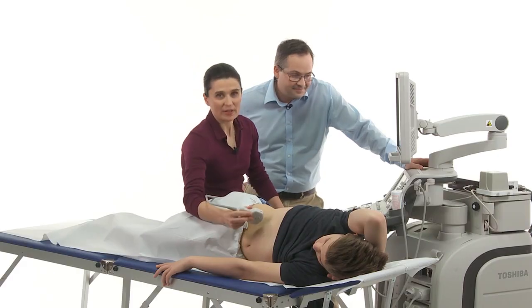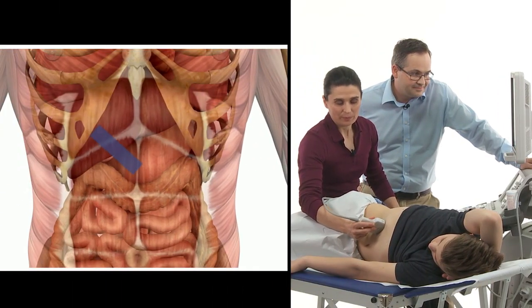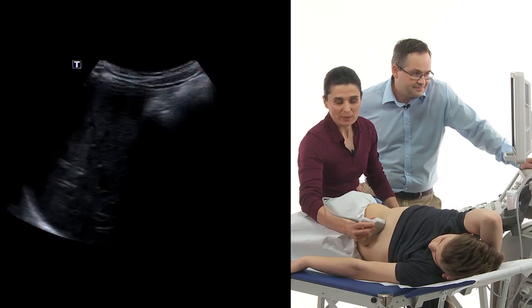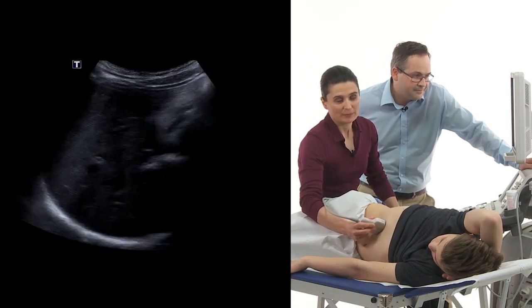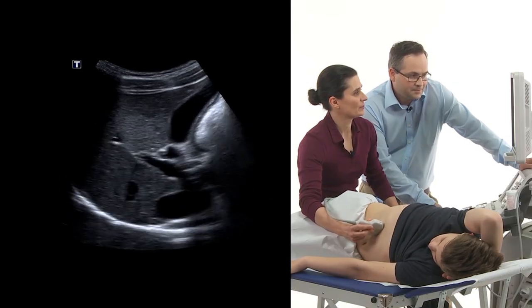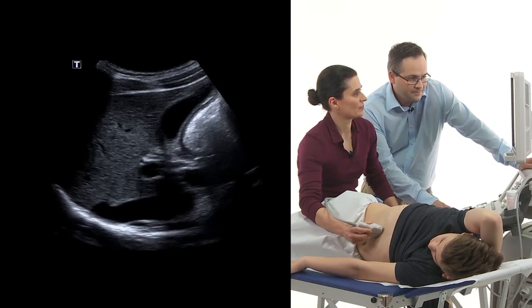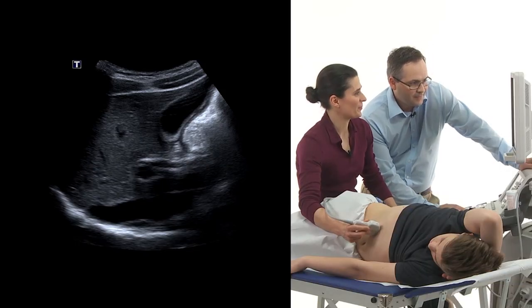I place my transducer under the right costal arch, at a right angle to the ribs. I ask my patient to inhale. So there you got it. Oh yes, nicely to see.